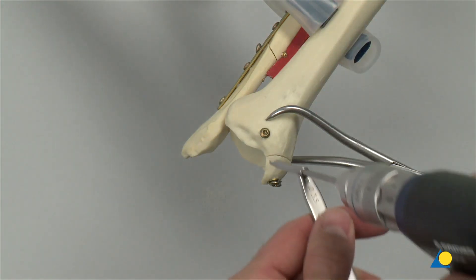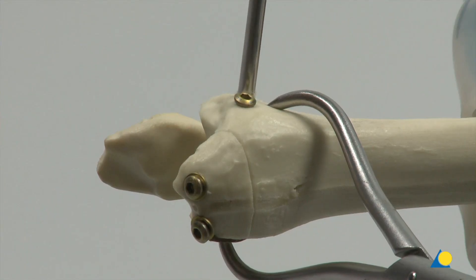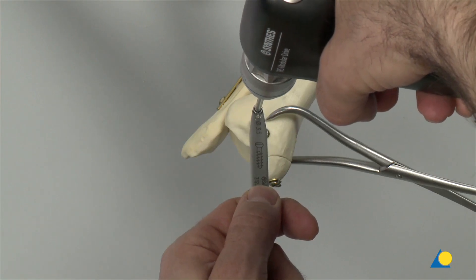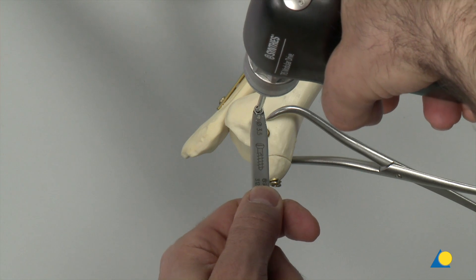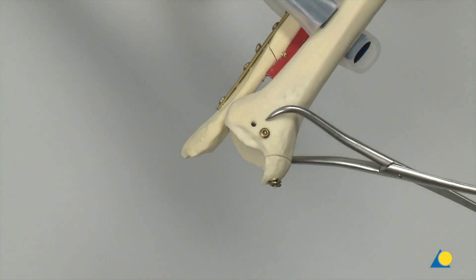If necessary, a second 3.5 mm self-tapping cortical lag screw can be inserted parallel to the first, to protect the fragment from rotation.